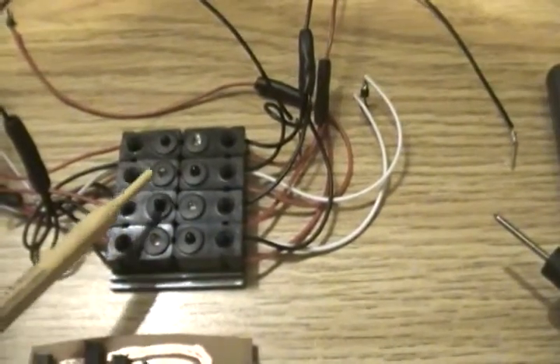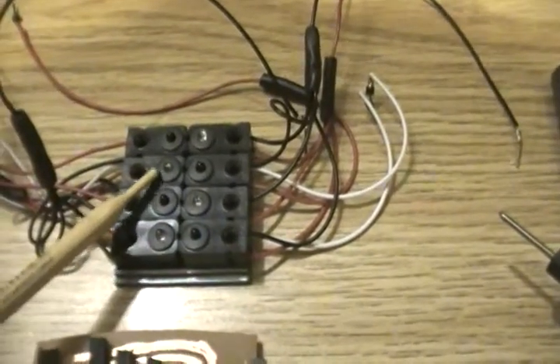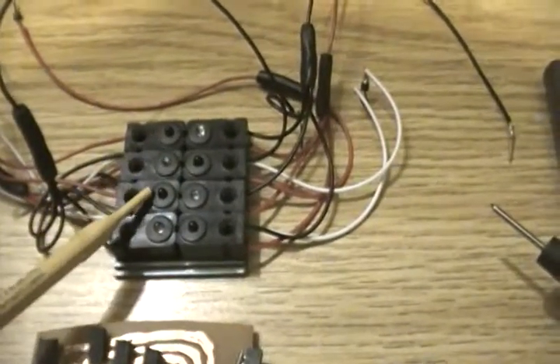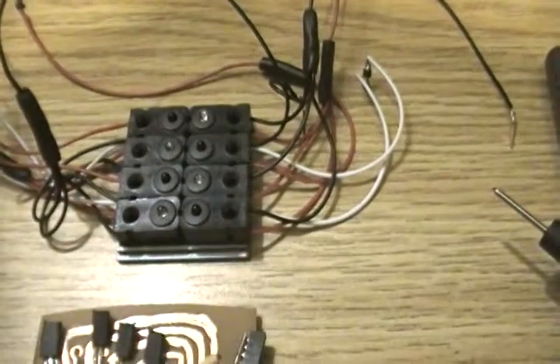So you have two LEDs on each side and two phototransistors, 1, 2, 1, 2, on the other side.